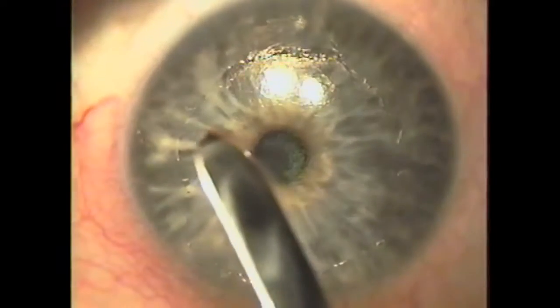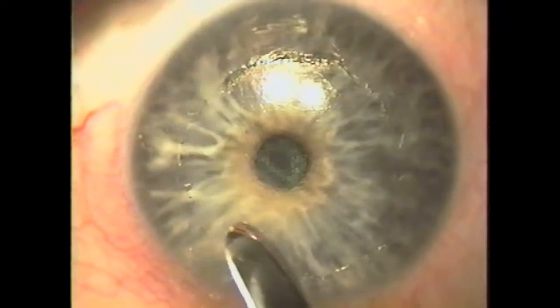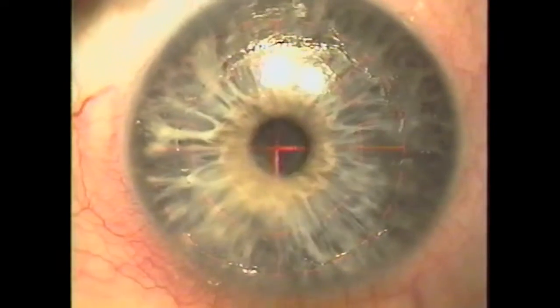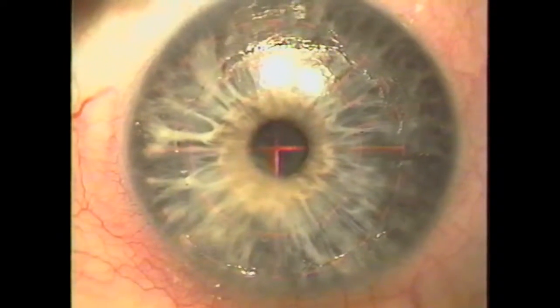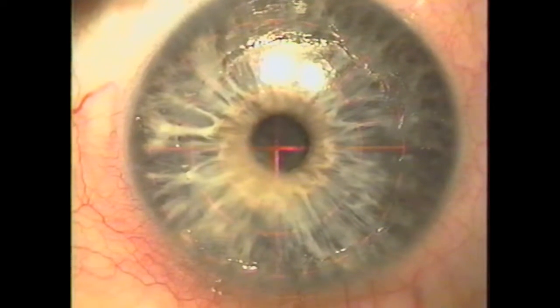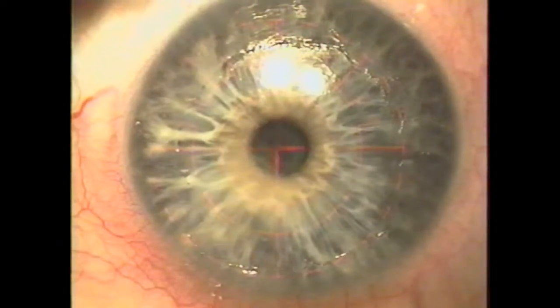Notice despite the smoothness, the opacity is still in its area, but that doesn't matter. You will proceed with a refractive ablation at this point.